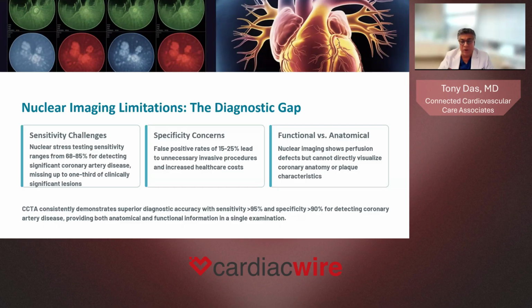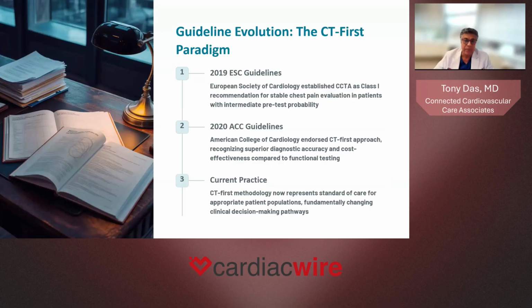And they give us not only anatomical consideration, which is what we thought CT scanning did, but also with these new AI programs, functional considerations of what the plaque really is, how it's behaving, and really potentially whether we should intervene on those plaques or do as Dr. Morales did in his case, use very high intensity reversing agents, lipid lowering, et cetera, and improve that plaque and reduce the progression. I thought that was a fascinating case.